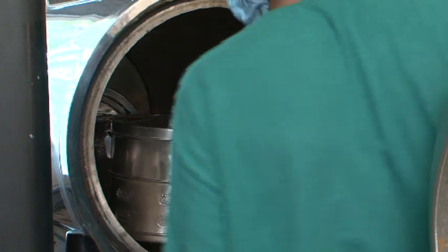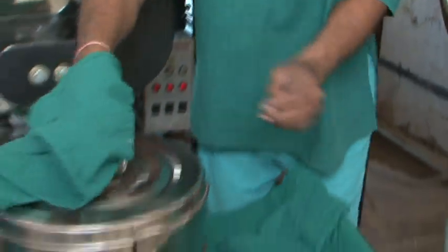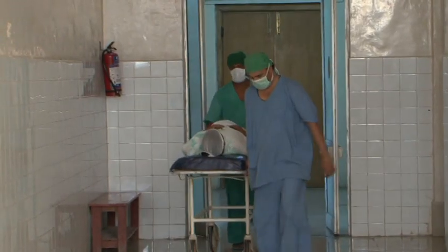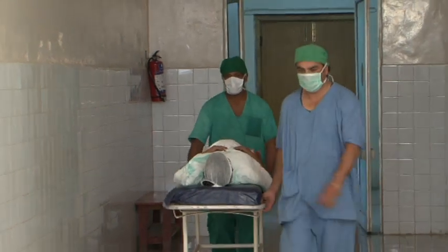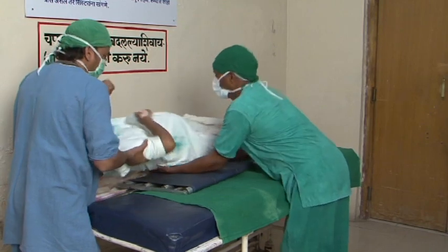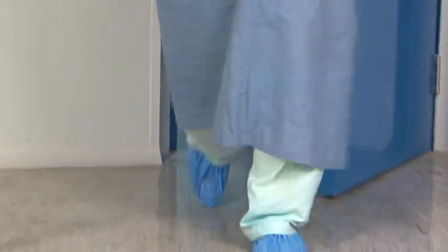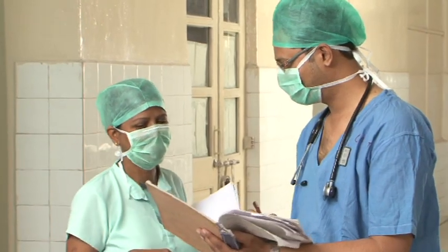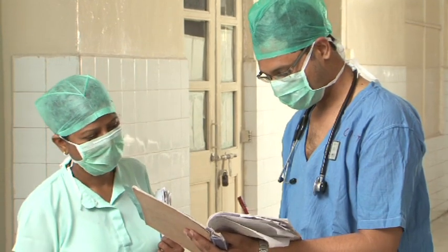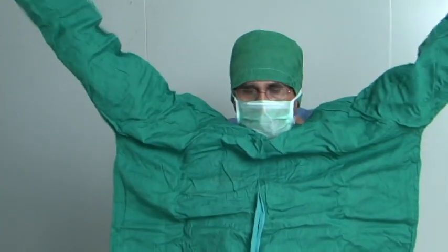Instruments to be sterilized by autoclaving. Each case should have separate autoclaved instruments set. Patients brought from antenatal ward or labour room should not cross the transfer area. Changeover of trolleys should be carried out in the buffer zone. The doctors, nurses, technicians and Class 4 staff should enter from a separate route and through a set of change rooms, communicating only through the sterile corridor. Space for changing shoes and gowns should also be provided near the change room.